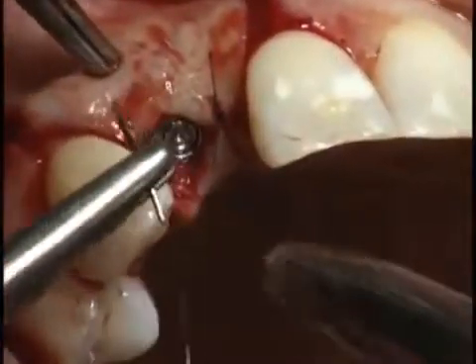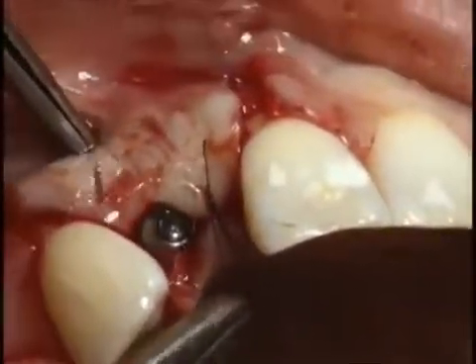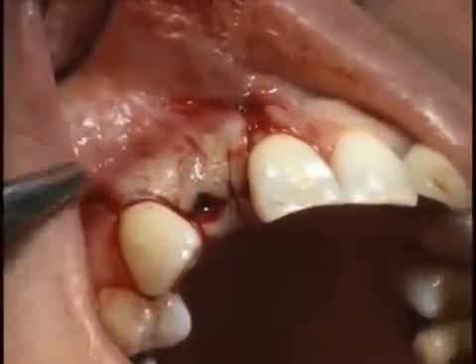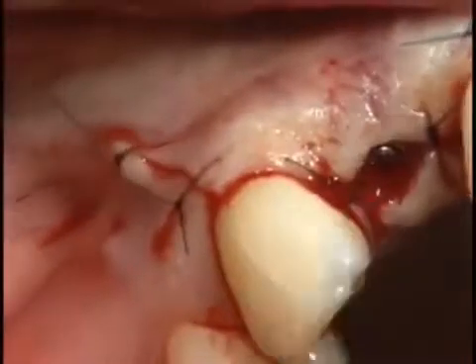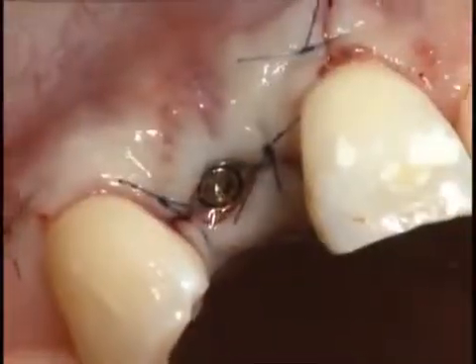The wound edges are approximated interdentally with atraumatic monofilament sutures. This is followed by closure of the vertical relieving incisions. The sutures are removed after about 7 days.